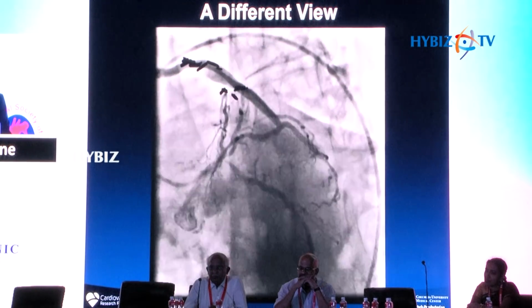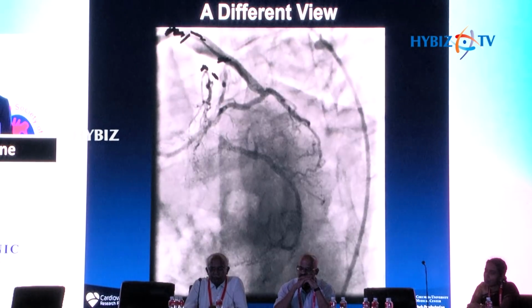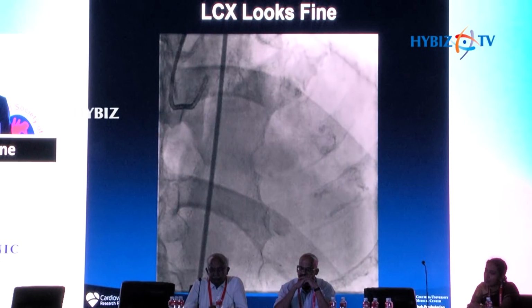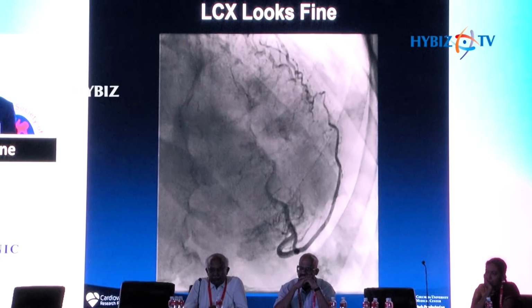This is why it's important to take multiple views when you do angiography and really identify what would in this case be important for the patient. Here's another one where if you look at this view, the LAD typically looks fine, and you can even look at the circumflex in this view.